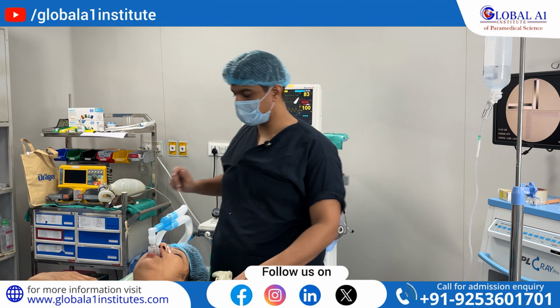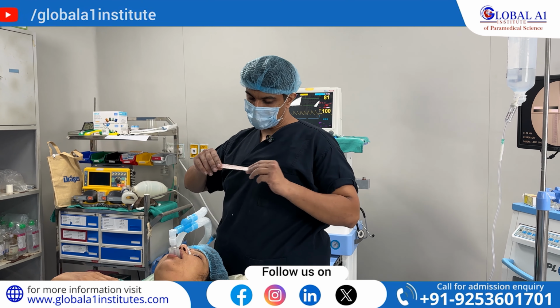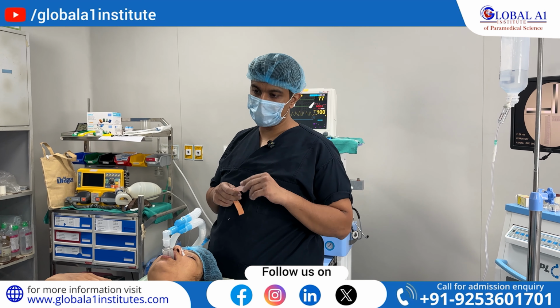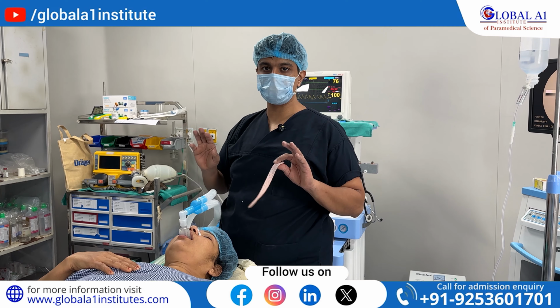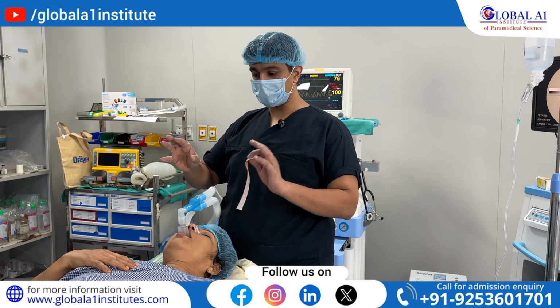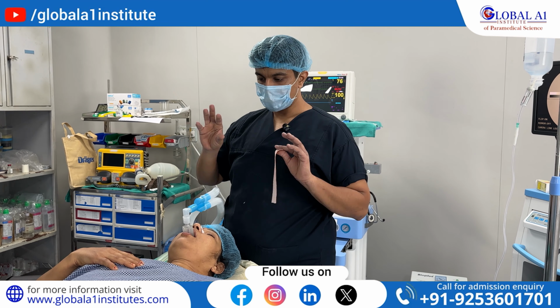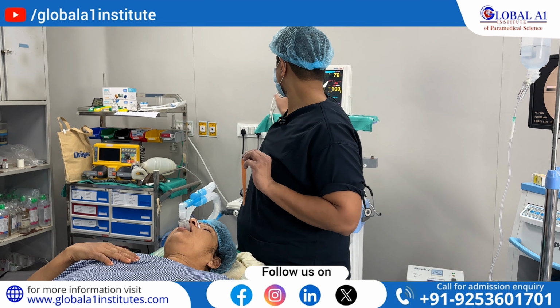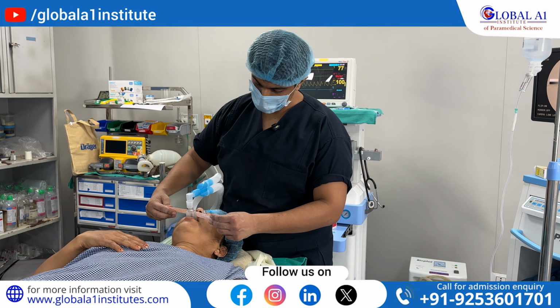As I have explained, we have done the pre-oxygenation, and the airway is now maintained with the iGel number 3, as it is chosen according to the weight of the patient. Now we are fixing it with a dynaplast and it is done. You have to check it with the physical rise of the chest. As you can see, I am quite safe as of now, as I can see the chest rise accordingly, and according to the monitor it is all okay. My vitals are all okay. Thank you.